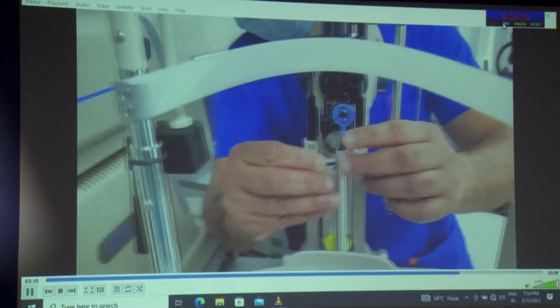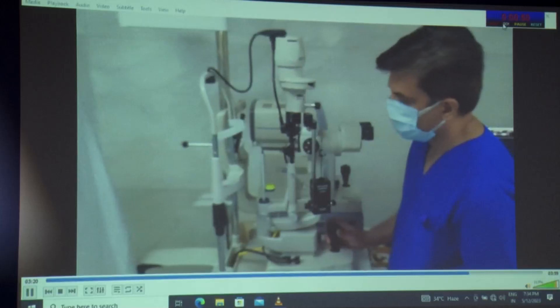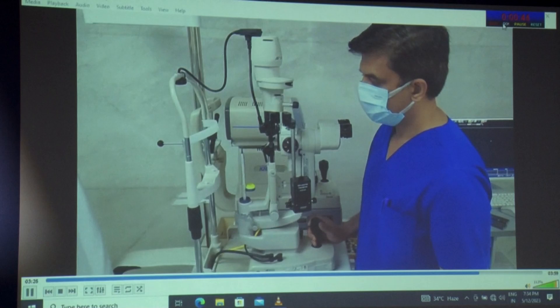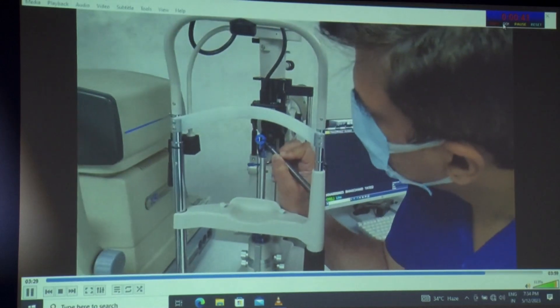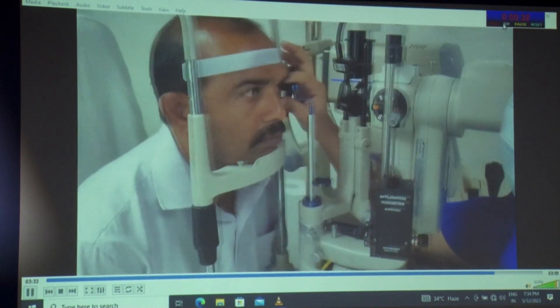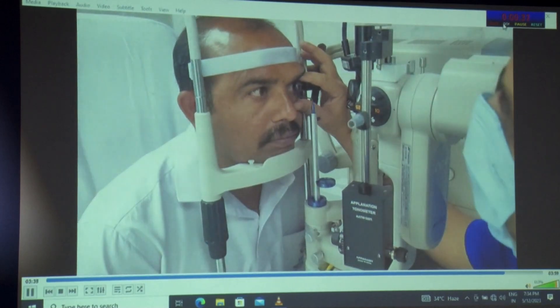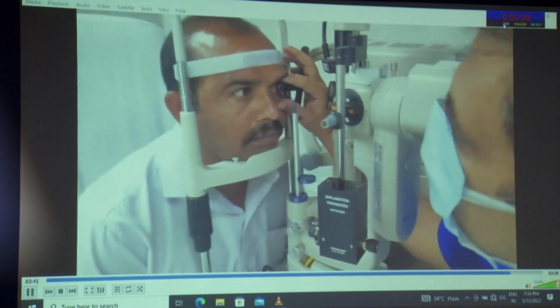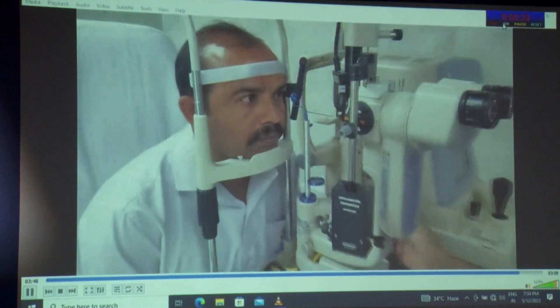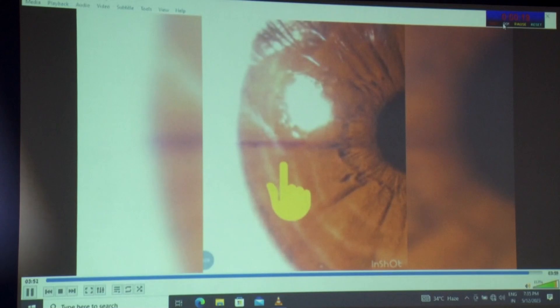The toric marker is fixed using the screw, and with the help of the knob of the slit lamp, the marker can be moved forward or back. We mark the toric marker using a blue ballpen, and the eye is indented beautifully — the patient is very comfortable. This is how the marks appear on the eye: it not only leaves a mark but also slightly indents the cornea at that particular axis.